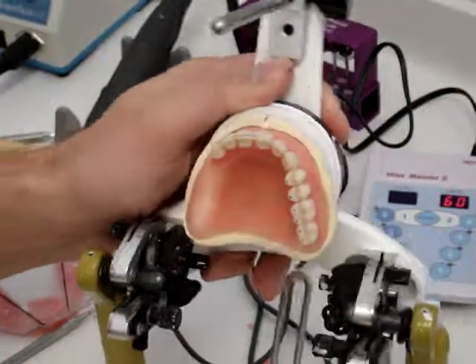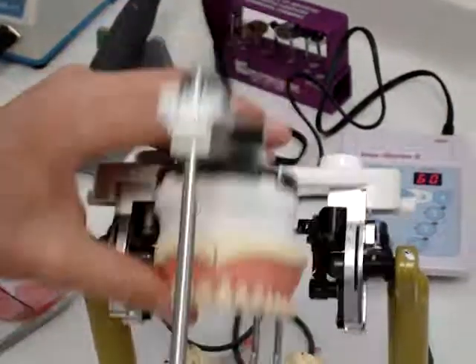So that's that. Now we'll set the other side, and then we'll move on to the mandibular.